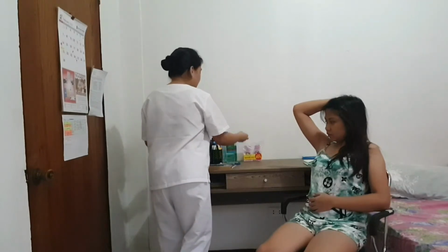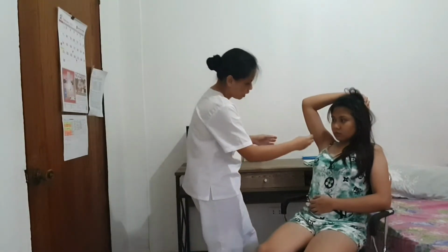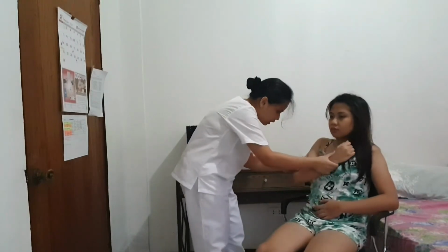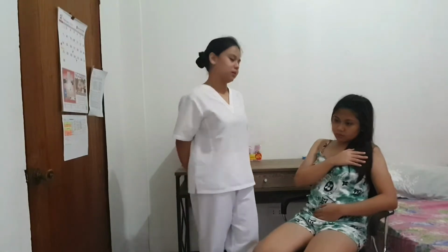Okay, this is the thermometer. I am going to wipe it from the bulb to the stem because again, the bulb is much cleaner than the stem. Okay. I'm gonna place it now. Okay, ma'am, please put it like this, your arms like this. Okay, so I will just wait until my thermometer will beep because once it has a beep, it means it already gathered the temperature of my patient.